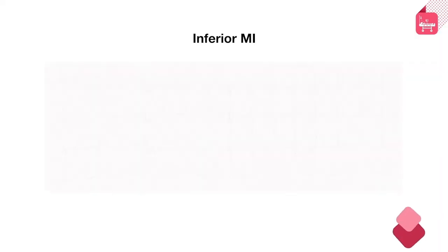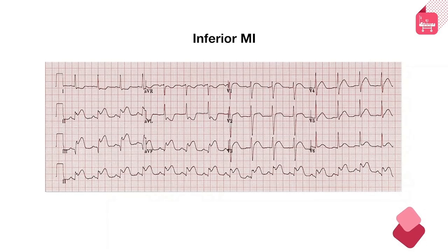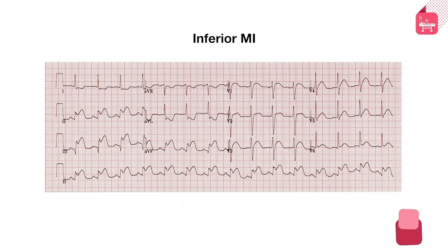This ECG shows gross ST elevation in leads II, III and AVF — the inferior leads — making this a case of inferior STEMI. The reciprocal ST changes are visible as ST depression in lead I and lead AVL.